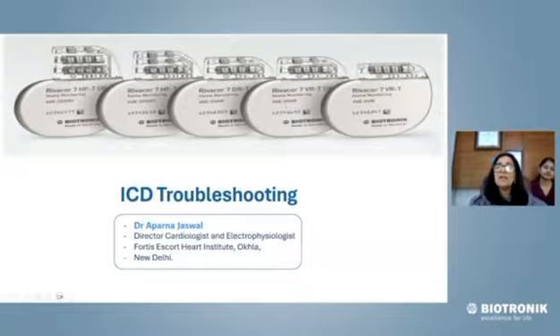So the first three letters are unique to defibrillator therapy, be it an ICD or a CRTD. You should be well aware of what this implies. Whenever we say VVE, the first letter means the chamber defibrillated. The next V is the chamber sensed and where ATP is possible. The next letter E is how it discriminates the rhythm, that is electrograms. So please remember this VVE is very distinctly different from the one that we use in pacing.